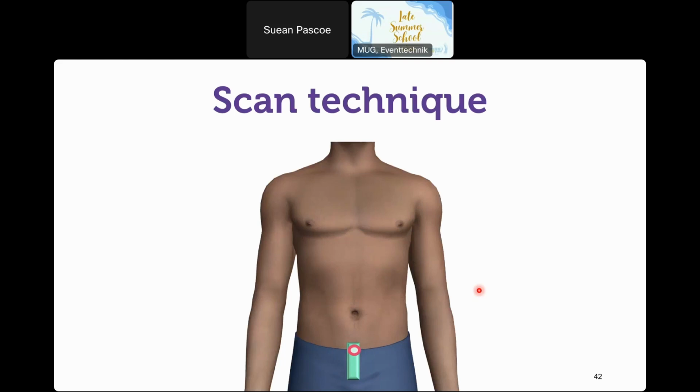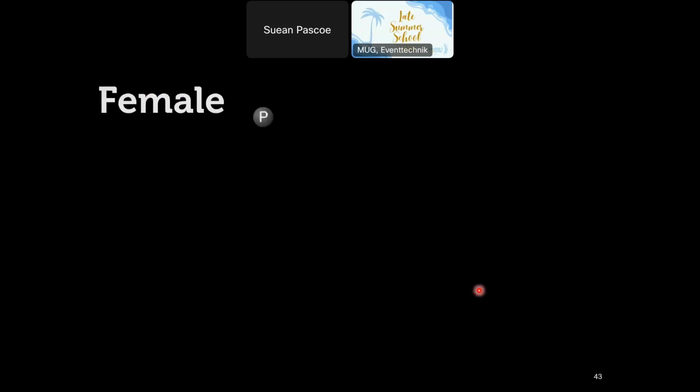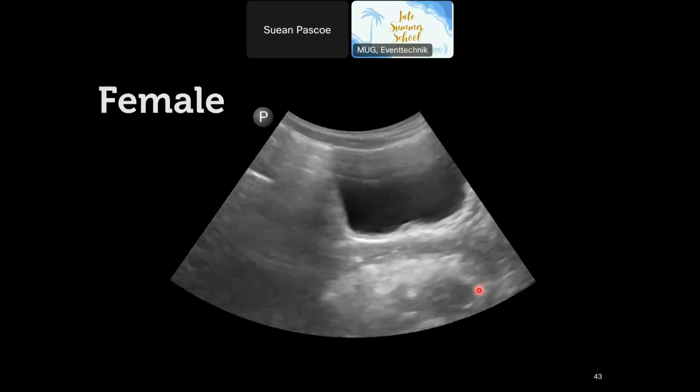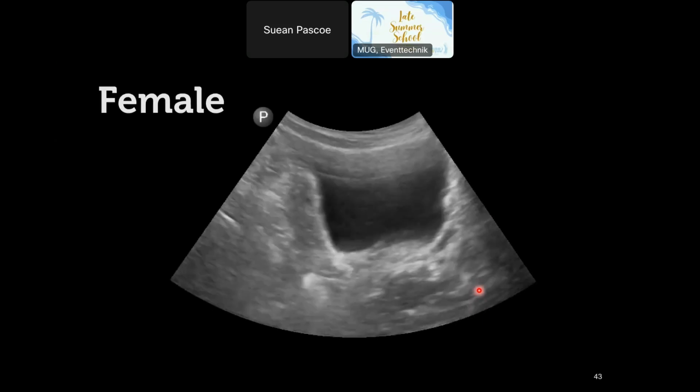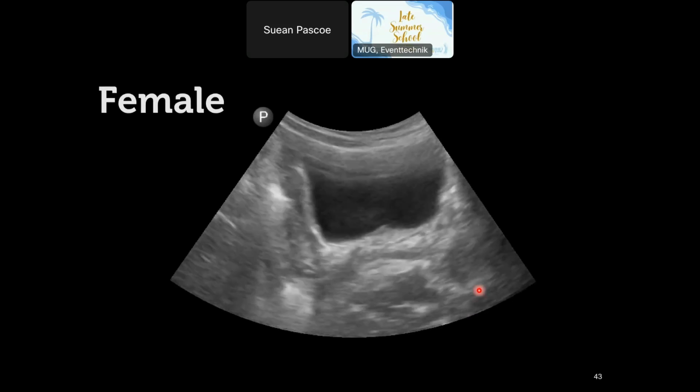So it's important that you scan the pelvis all the way from the iliac vessels to the opposite side iliac vessels. And if you're having trouble, then we're going to turn into transverse and make sure we go down to symphysis pubis all the way up to the umbilicus. You can see here as we scan through the pelvis, not just putting a still image in the midline.